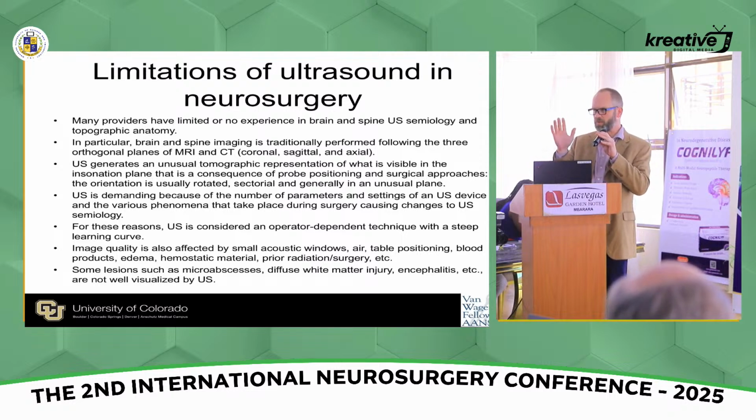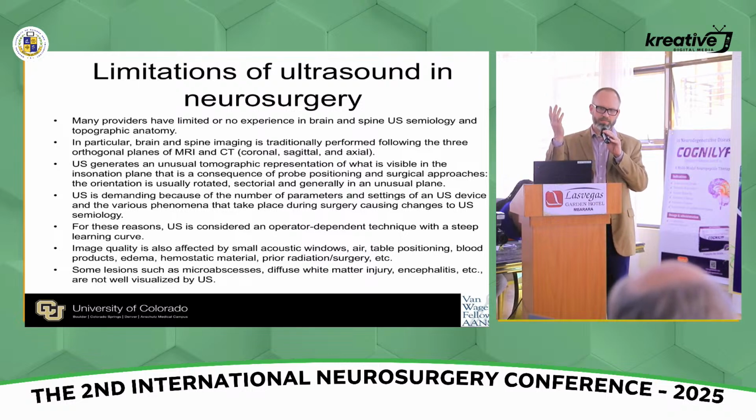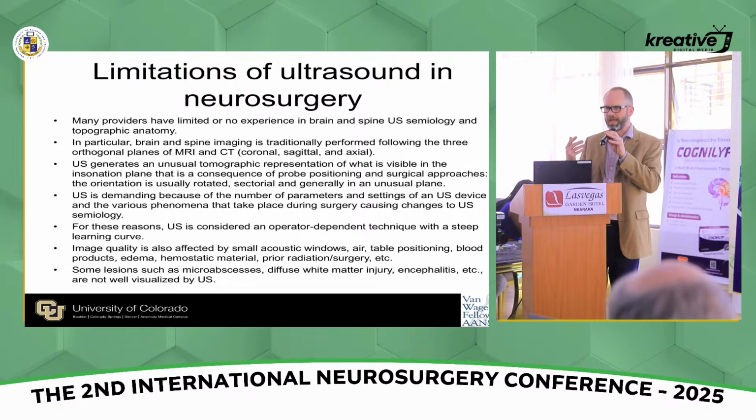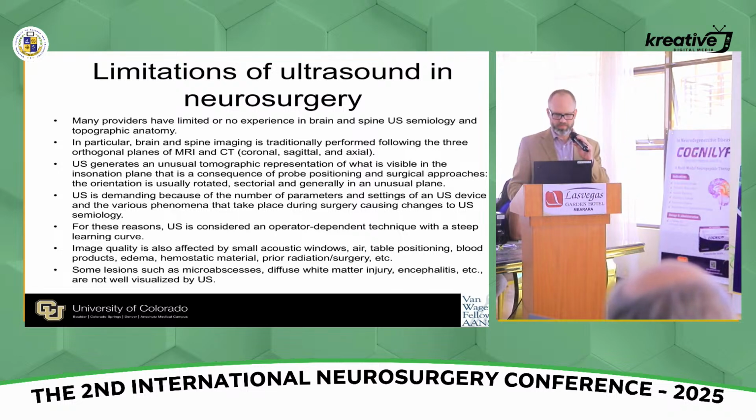Oblique views can be quite confusing, so it's important when you first start to look at an orthogonal view. And if you have a coronal option, that's often super helpful to start with a coronal view. So on a pterional craniotomy, start with a coronal view, okay?